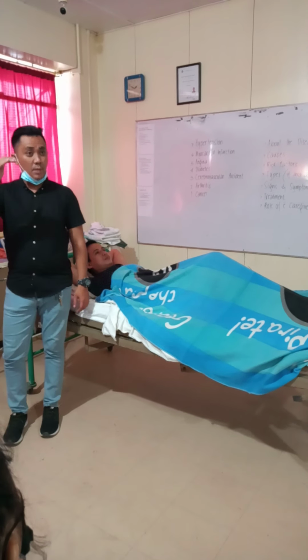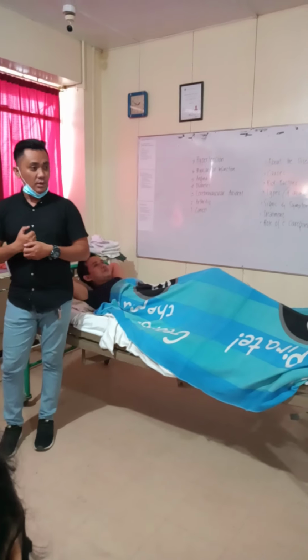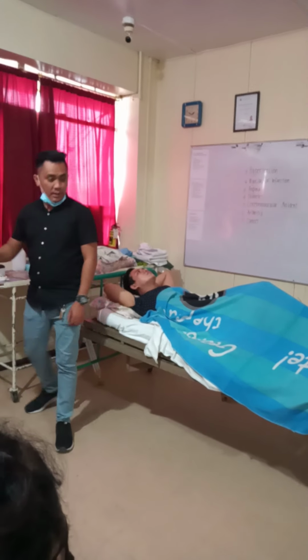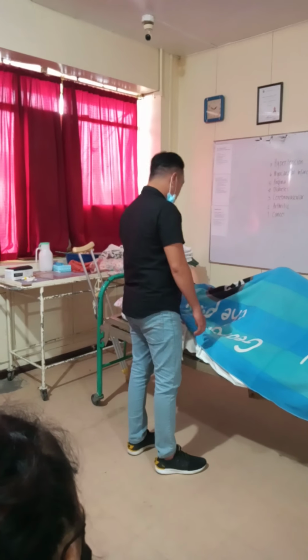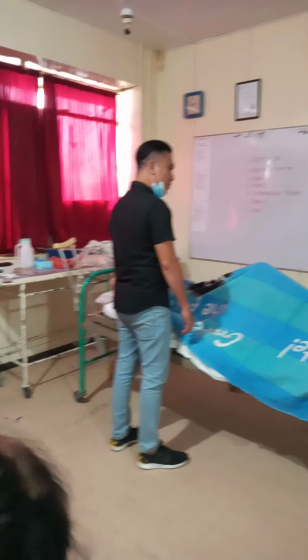For the procedure, it is in the notes. So first is knock on the door. Okay? Enter the room, then approach your patient and introduce yourself. Hi sir, good afternoon, I am Prince, your caregiver. How are you?